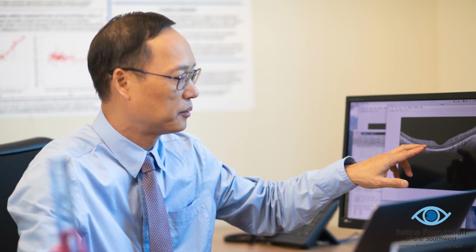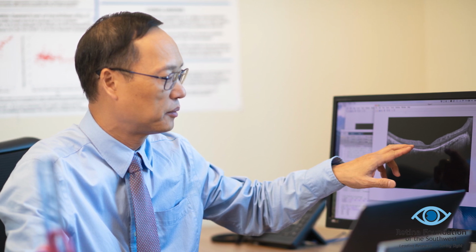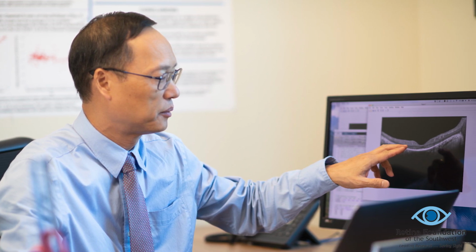Recent advances in artificial intelligence and deep machine learning offer us new tools to analyze OCT images for automatic measurements of retina structures. Deep machine learning works through a model called a deep neural network. This learning model is trained using a large amount of data. The machine learns from the dataset through training to extract features, so it can perform a task without a specific set of predefined instructions. Successful deep machine learning often requires a massive amount of data.